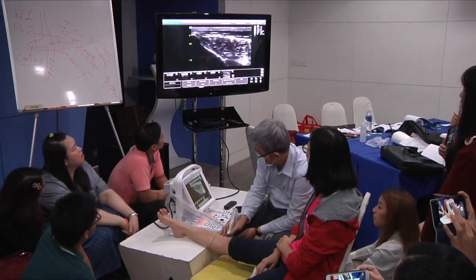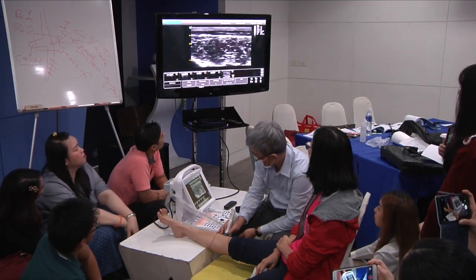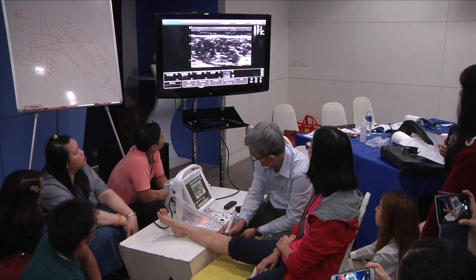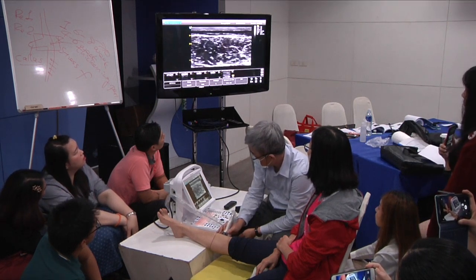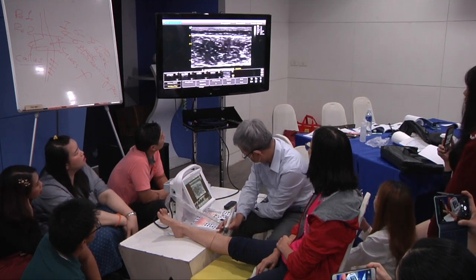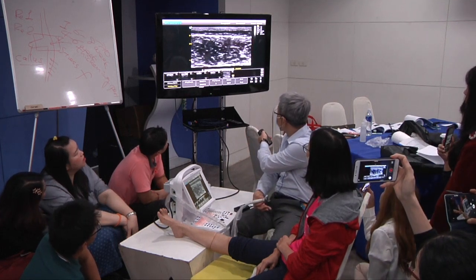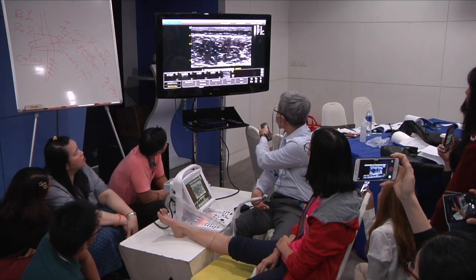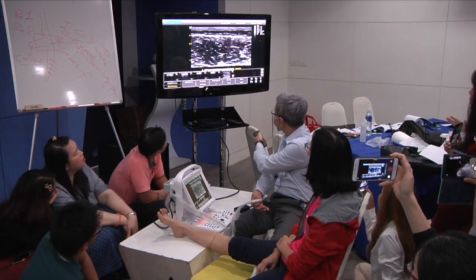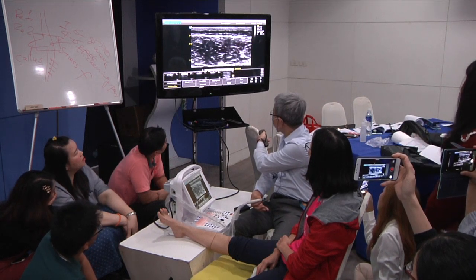Tibialis anterior. Good. The border between the extensor hallucis longus and the tibialis anterior appears. Yeah, it's a kidney shape. Kidney shape. And this is extensor digitorum longus.